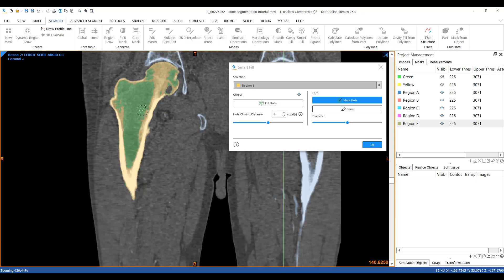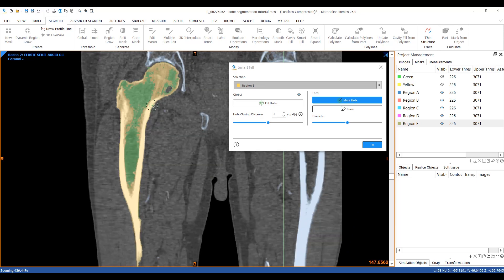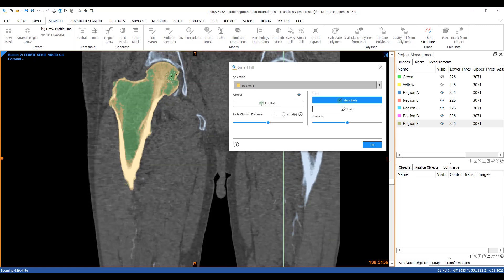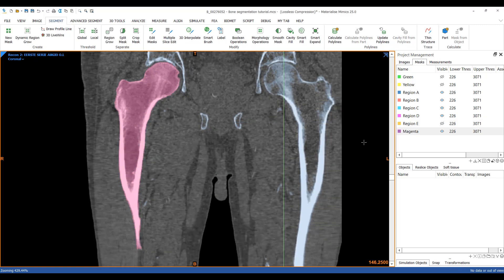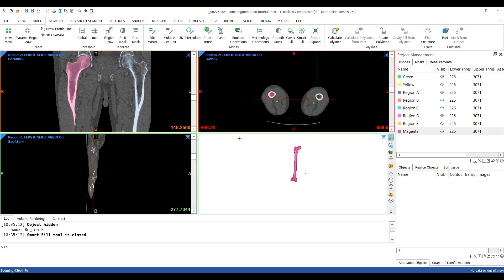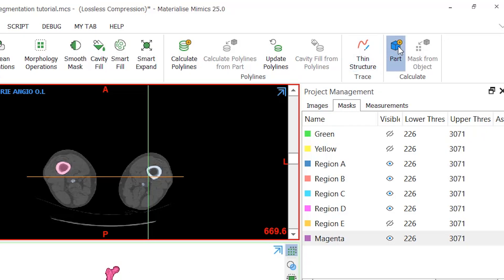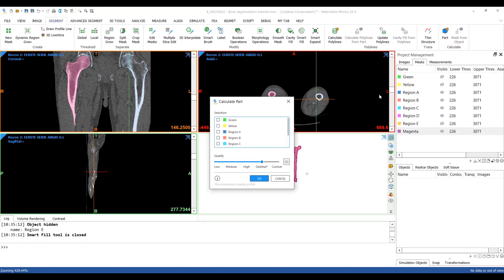Now if this result is not sufficient I can always mark the remaining holes with the same tool. Here's an example. After clicking OK the bone will be filled, and from there I'll calculate a 3D part with the quality set to optimal. We can do this by selecting the mask in the project management tab and clicking on calculate parts in the segment menu.